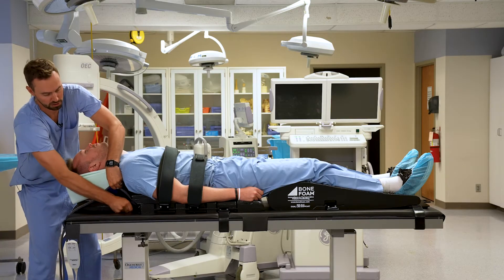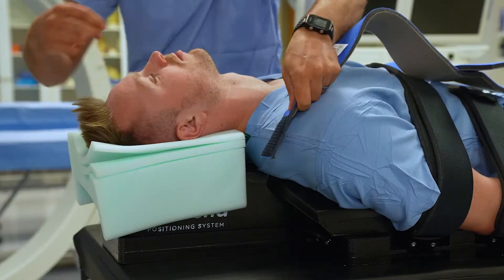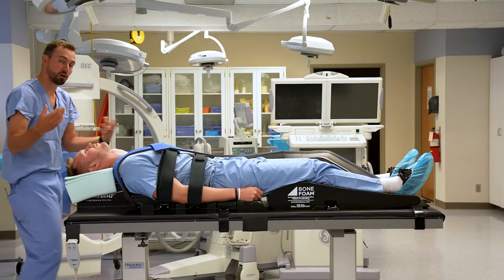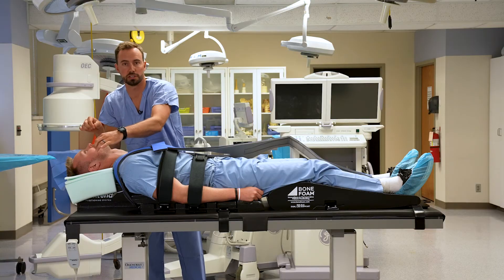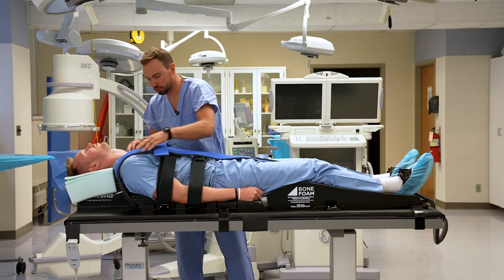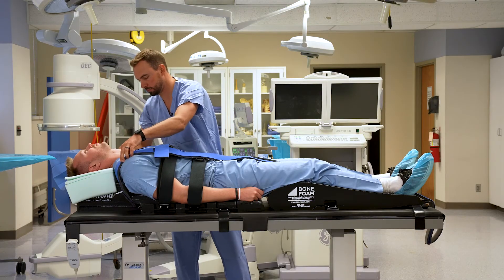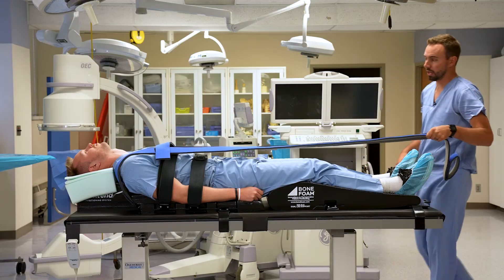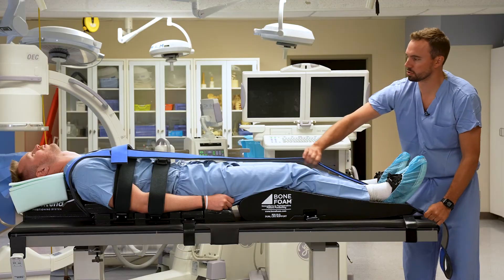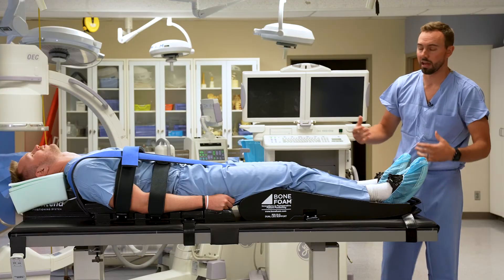Once the Y-strap is over his shoulders and we like where it sits on his AC joints, we want the yoke strap to be low enough — typically at or below the nipple line is safe for positioning. We have a traction anchor at the distal aspect of the bed. This traction anchor allows us to pull traction down on the shoulders, giving good depression of the shoulder girdle and maintaining static traction throughout the case.